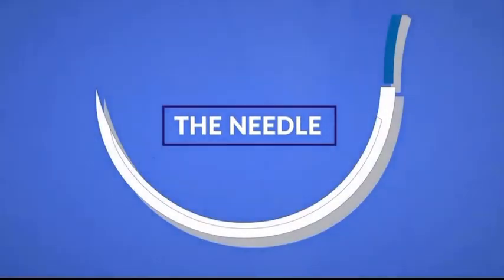In contrast, multifilament threads are braided. They are less slippery, therefore easier to handle intraoperatively, and are less likely to come loose during healing. This closes off my discussion of the thread. And now I'll move on to the next component of the suture, the needle.